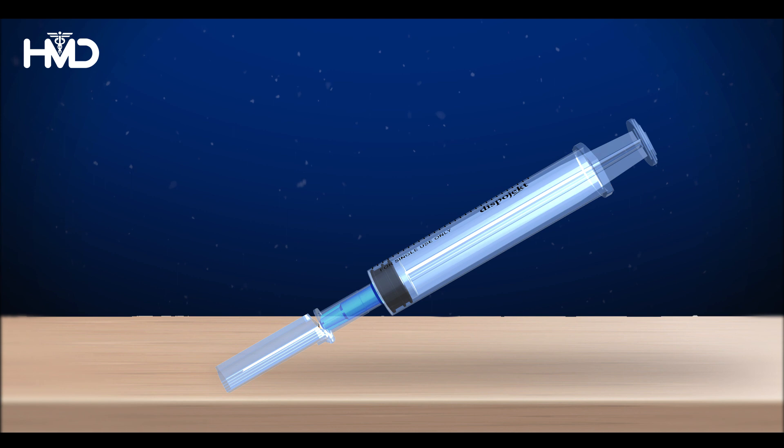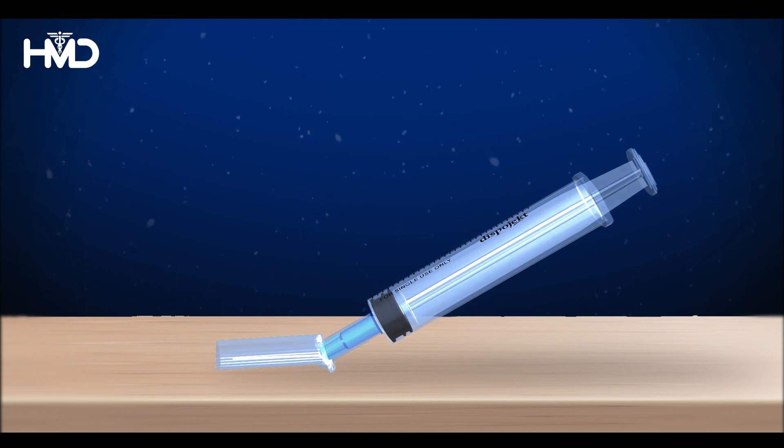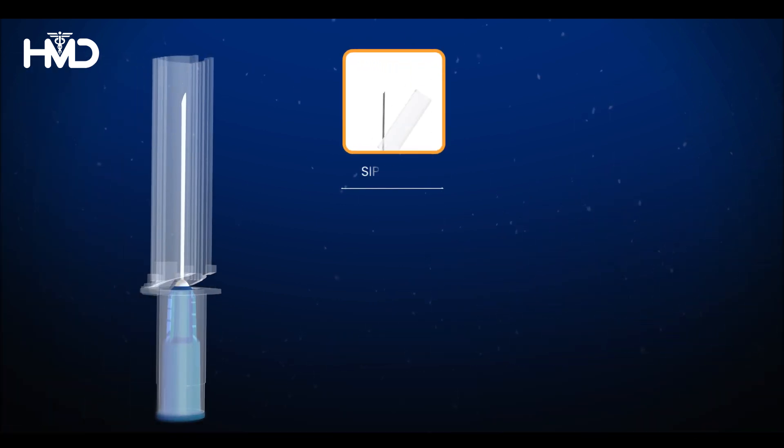Position the syringe at a suitable angle on the table and firmly press it down until you hear a confirming click sound. The click indicates that the needle is securely locked within the protective shield and cannot be reused.